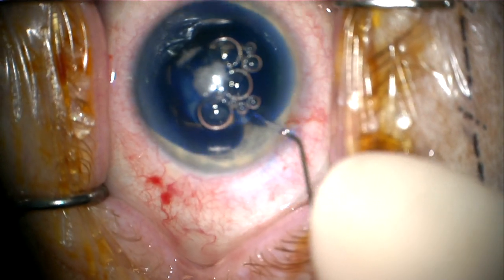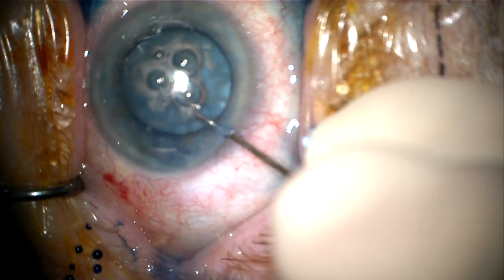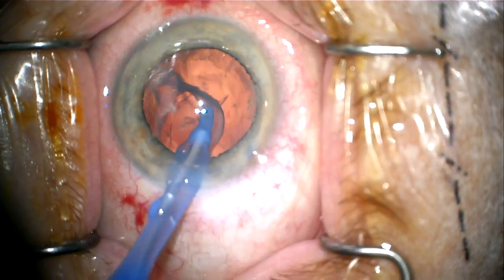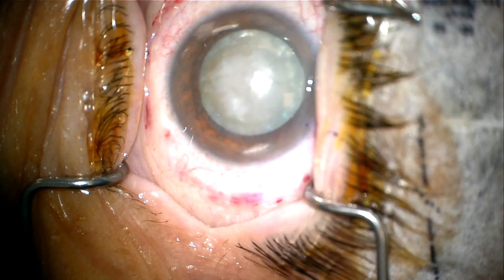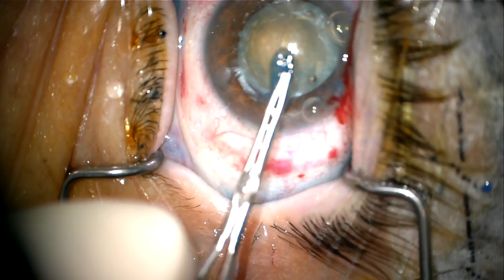You can see I've created the capsular rexis. I'm just staining with TriPan Blue. The big thing here is to make sure that you remove the lenticule, because you don't want this free-floating in the anterior chamber and getting lost. And you can see here, I actually have the lenticule laid out on the cornea, and you can see it's perfectly complete.